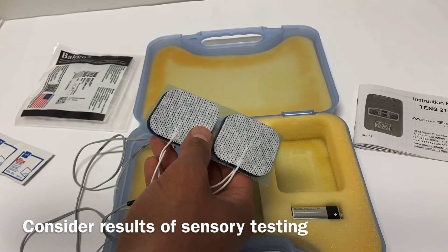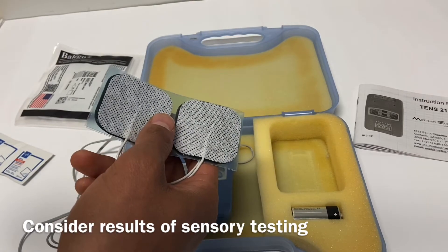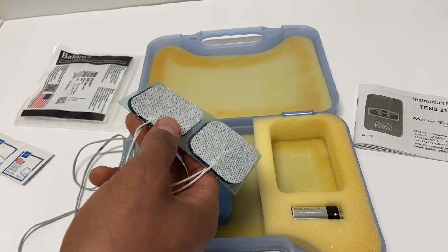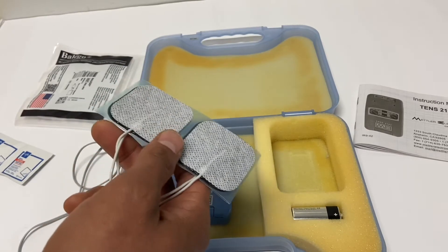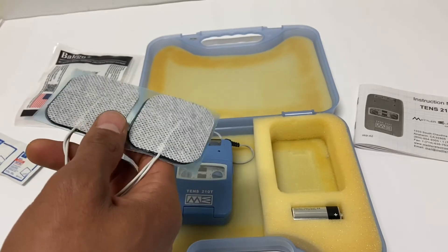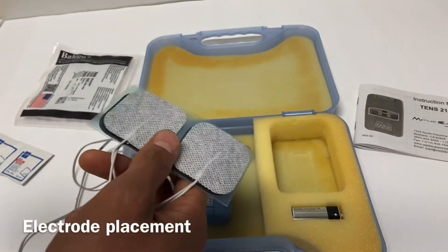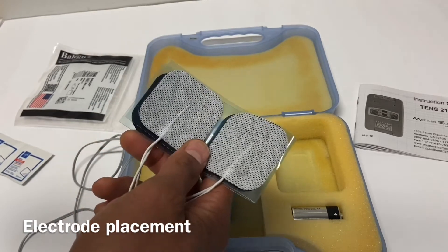If you did not get to sensory testing, we want to make sure we test the area where you're applying the electrodes for any change in sensation. If sensation is decreased, that's going to affect how much intensity the patient will tolerate. It doesn't mean you won't do the intervention — it just means you're going to be thinking more thoroughly about intensity level.